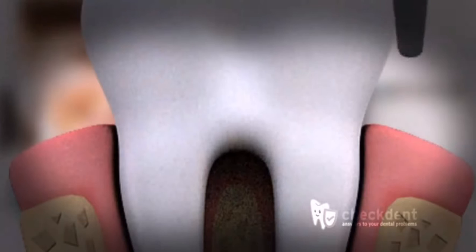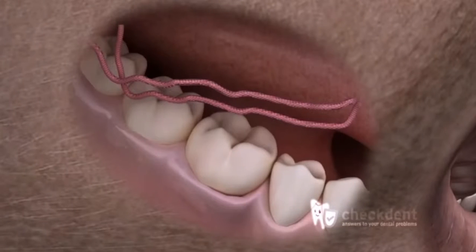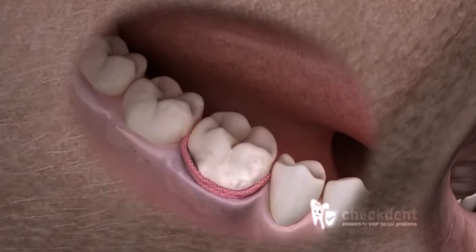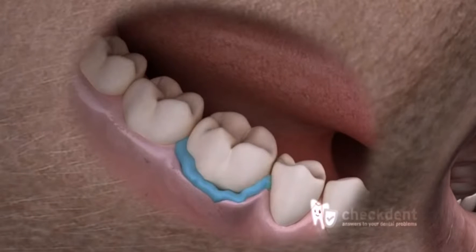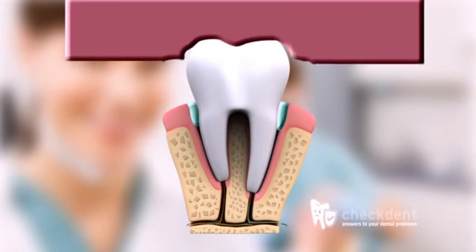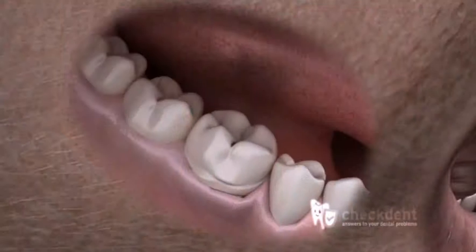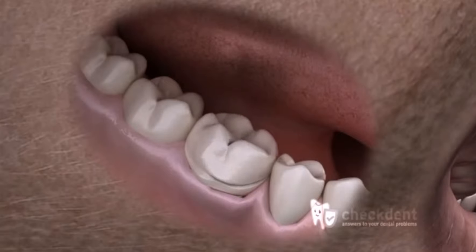To achieve a round margin, cutting must be performed under magnification. Furthermore, particular criteria must be observed while taking the impression. For example, before the impression is taken, 2 gingival retraction cords should be placed, one of which should be removed just before taking the impression. There are various pastes that can replace the gingival retraction cord, but sometimes these chemicals react with the impression medium and can cause distortion. The result will be an ill-fitting crown.